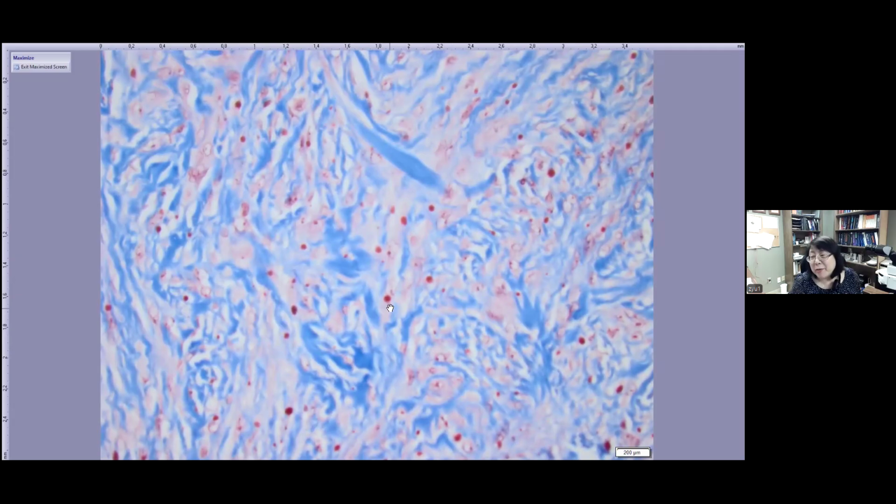So by trichrome, those inclusions are red. And people may ask, how can you tell? Why is this not red blood cells? Red blood cells, you can find some contrast. Red blood cells are usually uniform in size, not like this, variable, large, small, tiny.